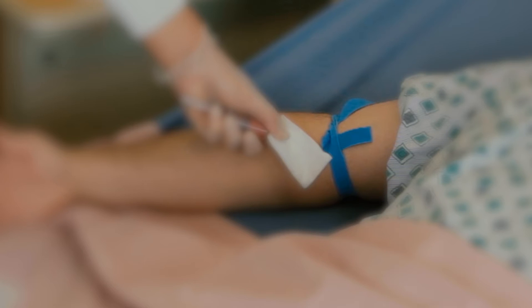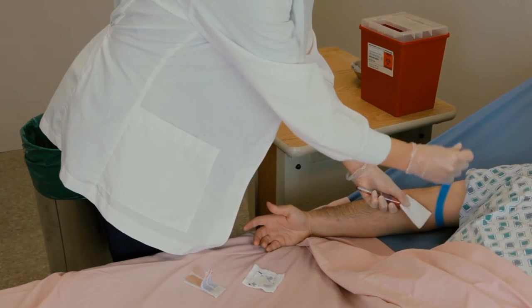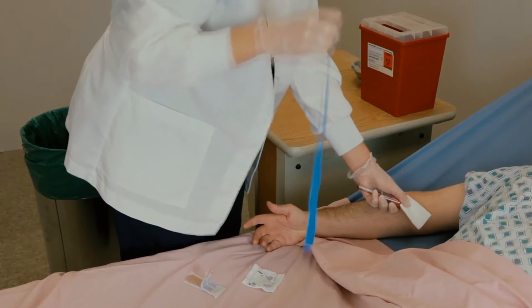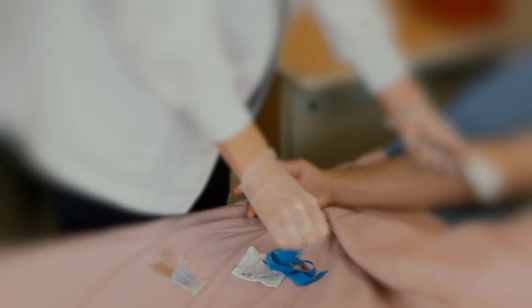A phlebotomy is being performed on this patient. Notice the flash of blood in the vacutainer and tube. It is important to remove the tourniquet at this time so as not to exceed 60 seconds, which could affect the laboratory results and so the tourniquet is not forgotten and inadvertently left on the patient.